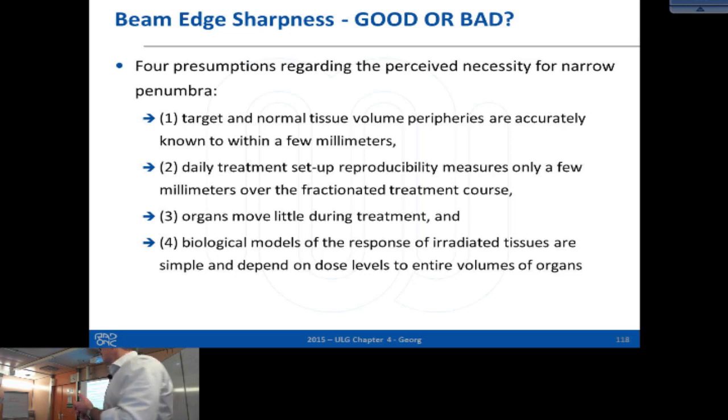What's done. The next discussion that is coming, also with all this image guidance, is that when we're doing cone beam CT on a daily basis, we give a lot of low dose volume, not only in the place where the cancer is located, but also to organs at risk. So nobody knows what the long-term effect of all these low doses to bigger volumes is by performing imaging. That at least comes from the radiation protection people.